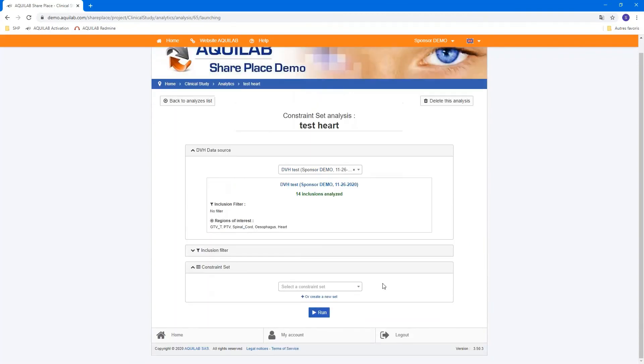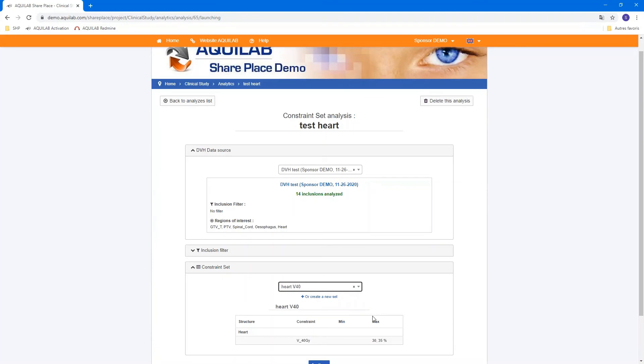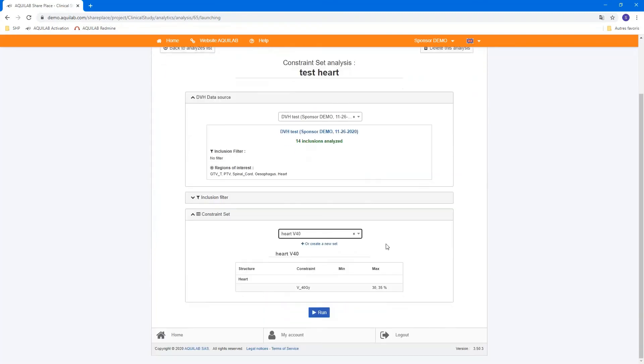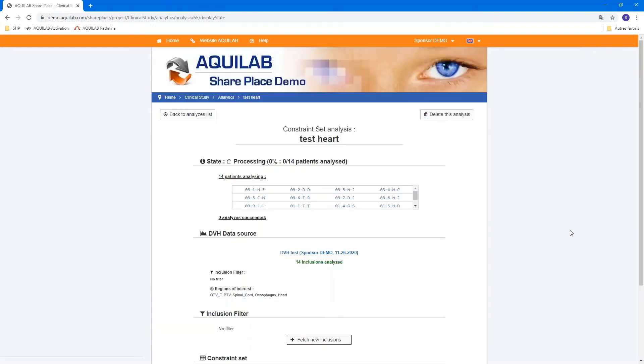Based on the same way to the DVH. And now you can select a constraint set, for example, and you see its summary below or create a new set if it's needed. When the DVH data source was selected and inclusion filter selected too, we can run the analysis.